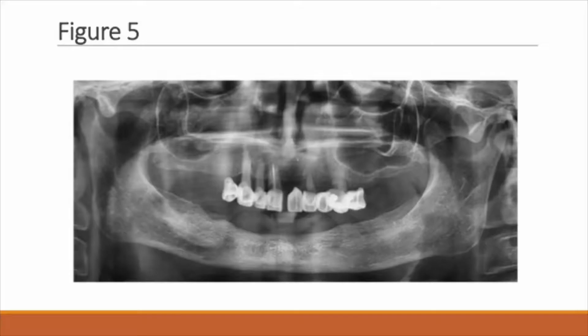The patient presented to the implant practice asking if it was possible to receive implant therapy to stabilize a removable denture. The patient has been in pain since cancer surgery and is edentulous with no denture to prevent tissue compression. Panoramic radiography as well as CT scans allowed for a plan to place 2 implants in the retroforaminal area and 2 in the area of partial mandibulectomy. Note the reduced alveolar bone in the area of partial mandibulectomy on the panoramic radiograph in Figure 5.